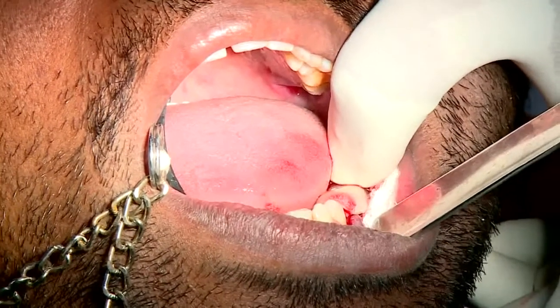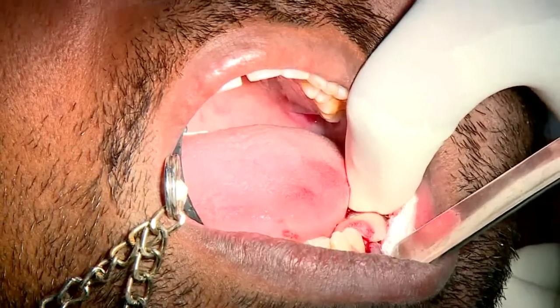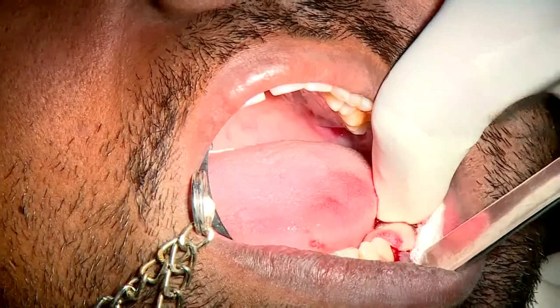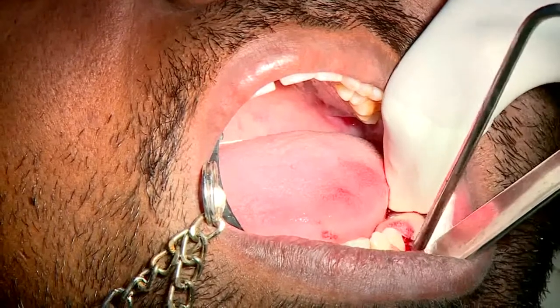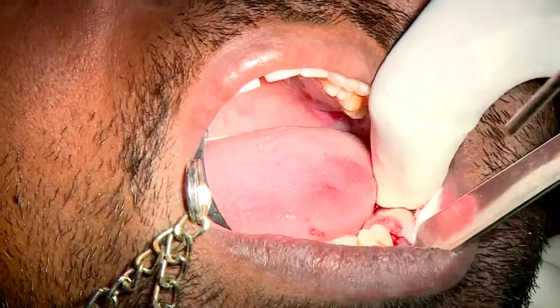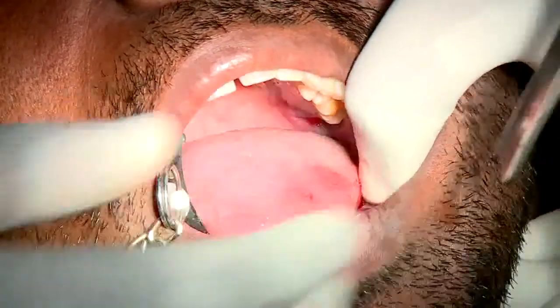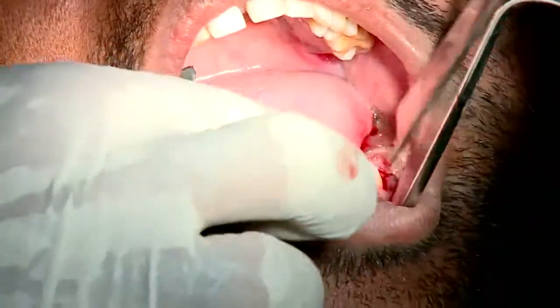You can't put in a foundation where it cannot be restored. Then you call that a failure. Even if your implant is so strong, you will call it a failure if it cannot replace a tooth. That's the reason why we keep saying it is a prosthetic driven specialty.